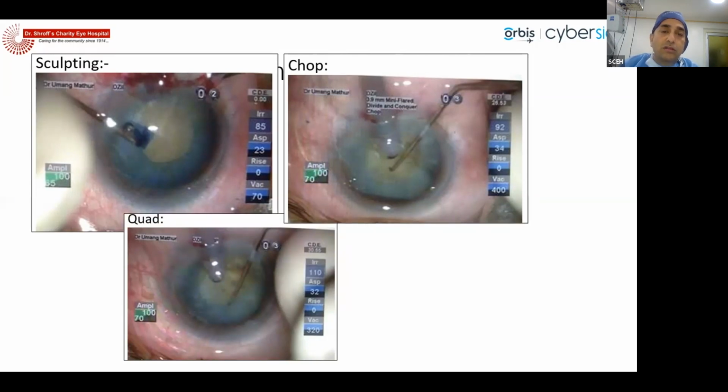In torsional phaco, Alcon has something they call intelligent phaco. You turn it on when you're doing quadrant removal, because torsional phaco sometimes just drills a hole inside the piece, and that piece can sometimes clog the tubing. Also, you need to use your second instrument to dislodge it at the tip to come out of the drill that torsional phaco has made. So it gives a burst of longitudinal phaco when it gets occluded, and that helps in getting the piece in and also presenting the piece at a better location.